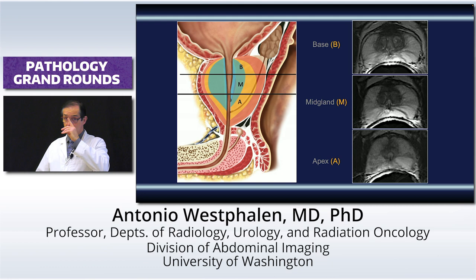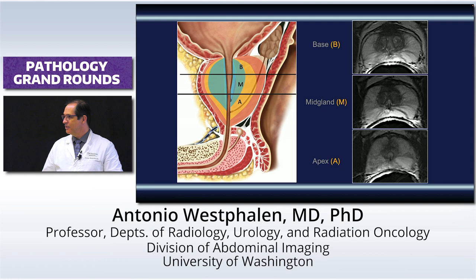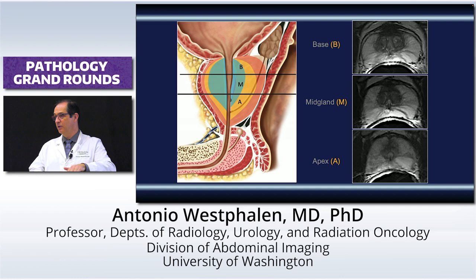Now, it matters a little bit because when urologist does it, they have a transducer that is angled this way. And the beam of the sound also opens up like light, right? So when they talk about midgland, base, and apex, it's probably not the same thing as we're talking about. And it's important for you guys to know what we refer to. So we're literally just doing one third, one third, one third, if we want to then correlate.